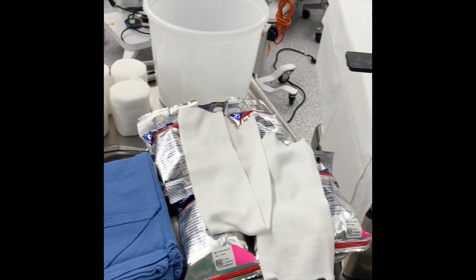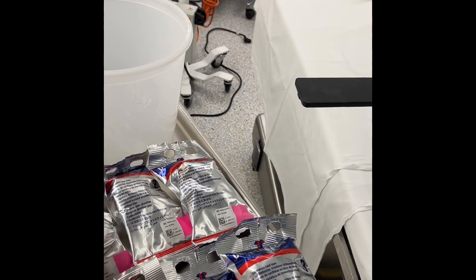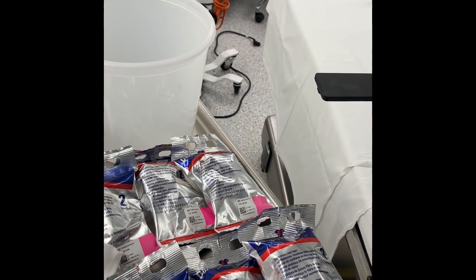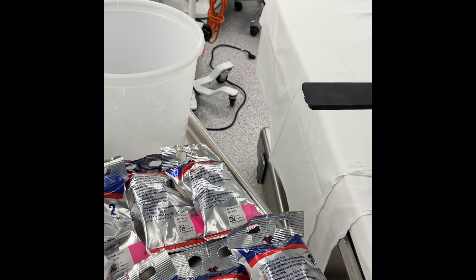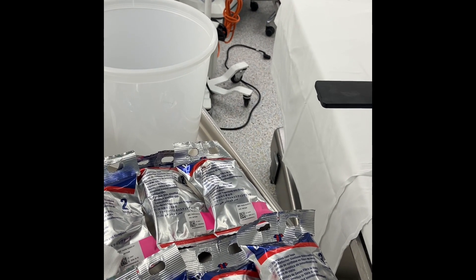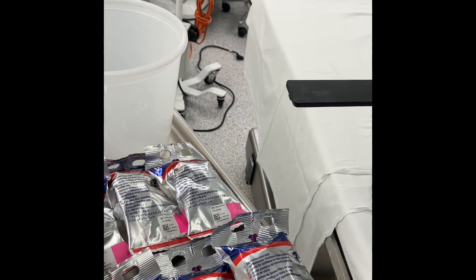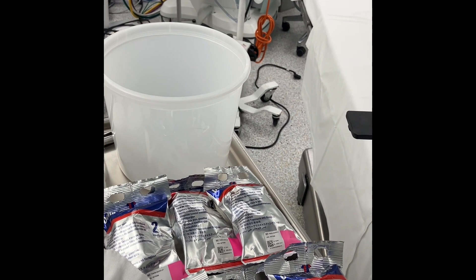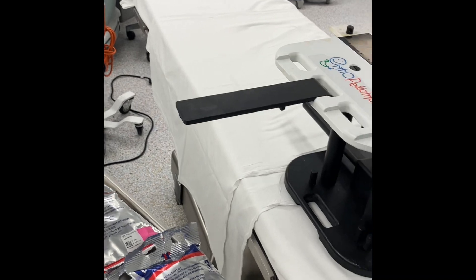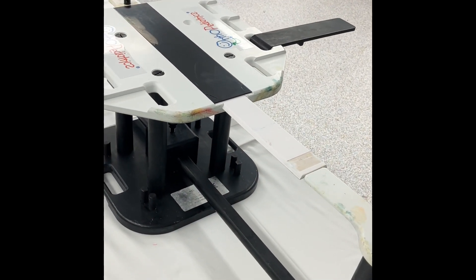Once they get all of the soft roll around the patient's waist and leg, they'll start opening up the casting material. I don't open them — I let the doctor open them — because sometimes we use less, sometimes we use more. If you open it, it is wasted if it isn't used because these will dry out really badly. They will open them individually, dunk them in water and make sure they're soaked really well, and then wrap the waist and the leg with the casting material.